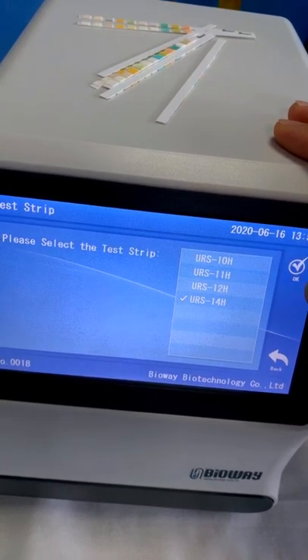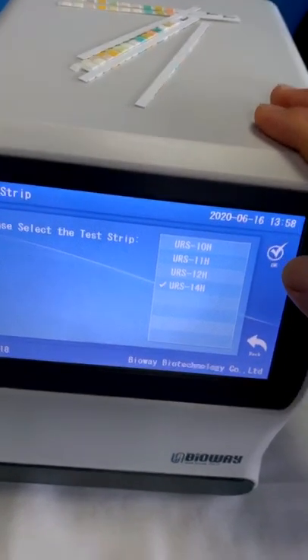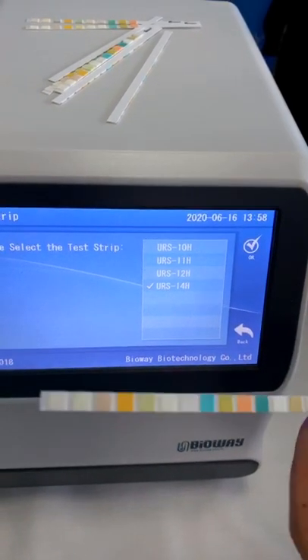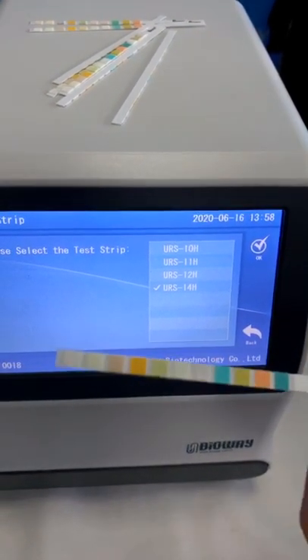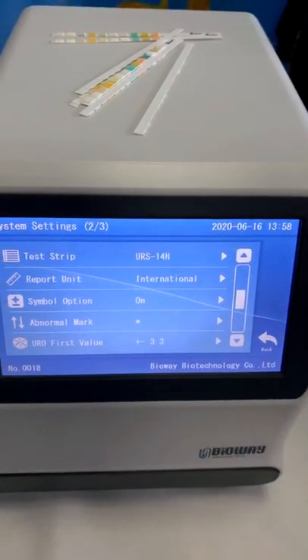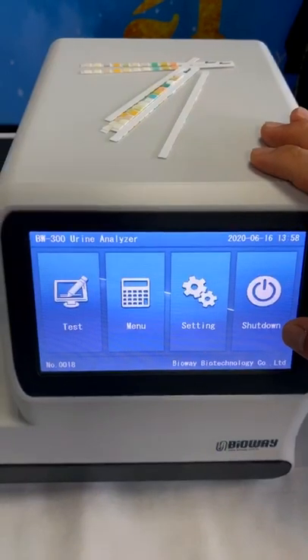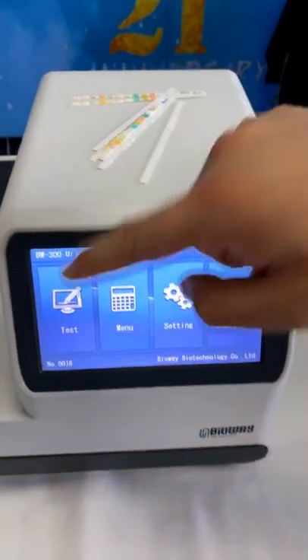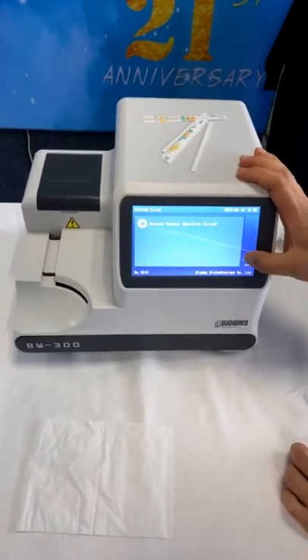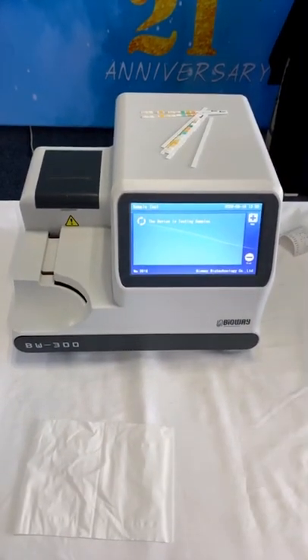So before the test, we need to have a check. Yes, we have to figure out which type of urine strips we are going to use. Click OK, go back to the homepage, and click test. OK. And the test starts.